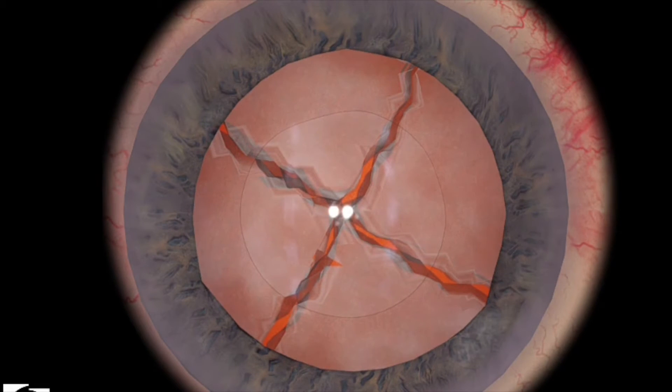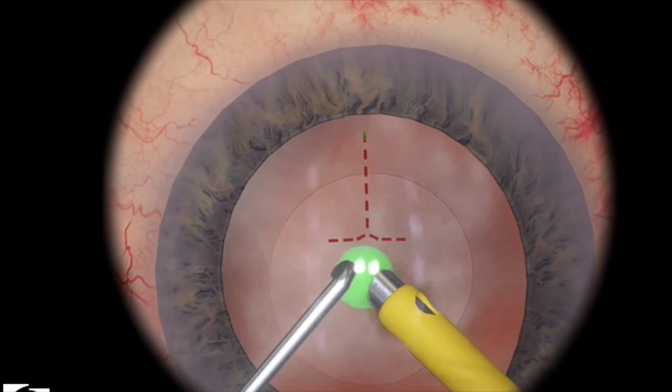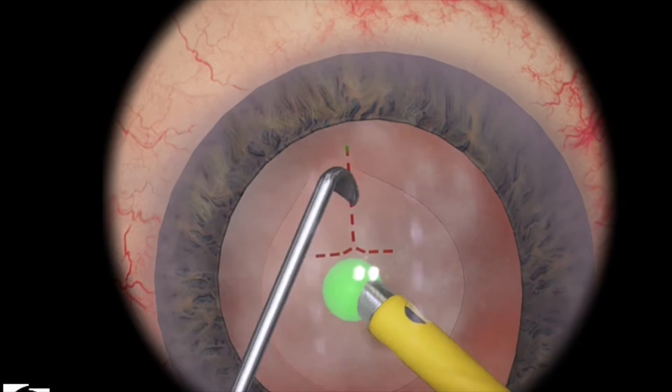High aspiration or high vacuum settings are key as well. Turn it up maybe 30 or 40 points from what you have in your quadrant removal 1 setting.